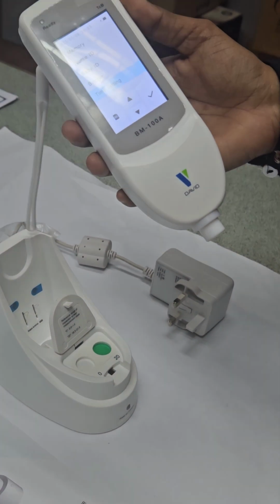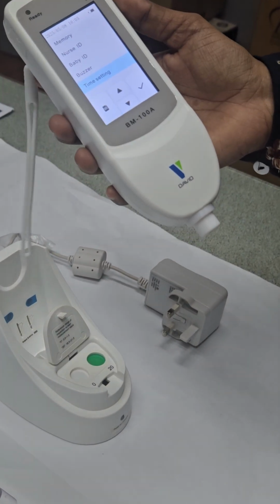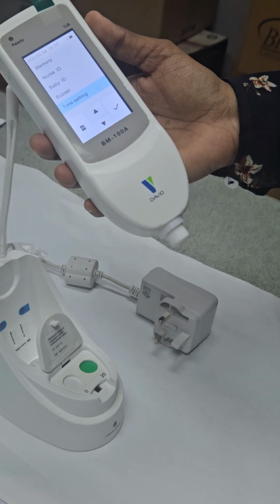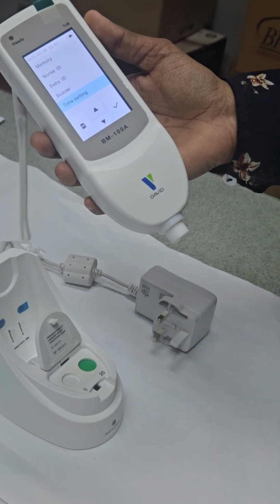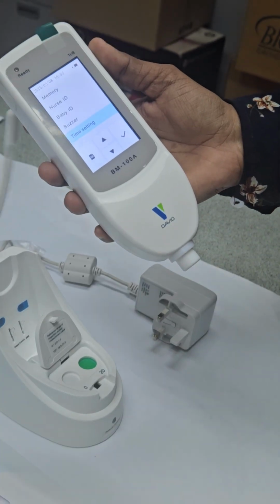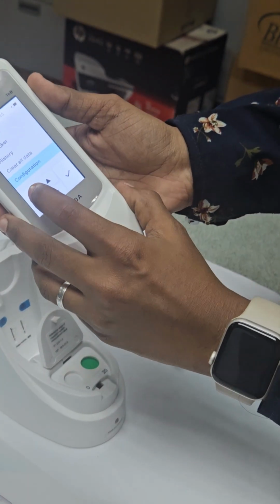No, actually the result depends on what unit they are using, but it depends on the baby actually. So the doctor, the pediatrician, will define whether it's high jaundice or a normal range. Okay. But there's a reading for that also, yeah.